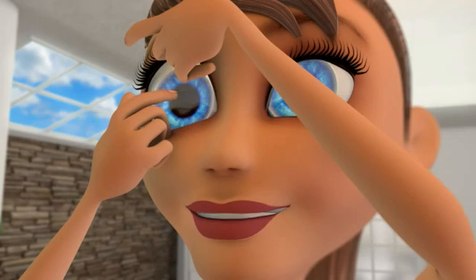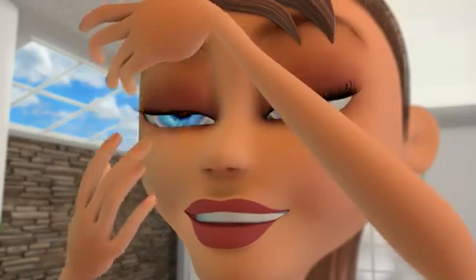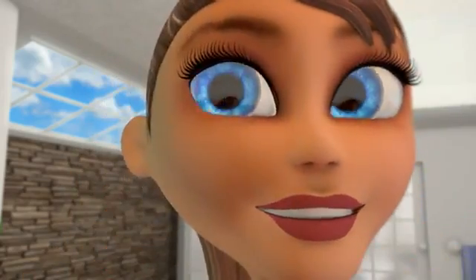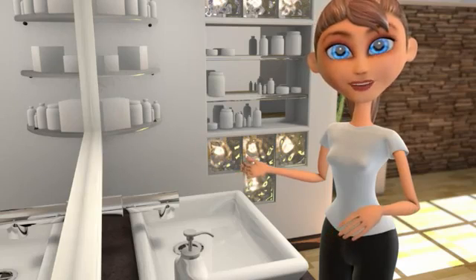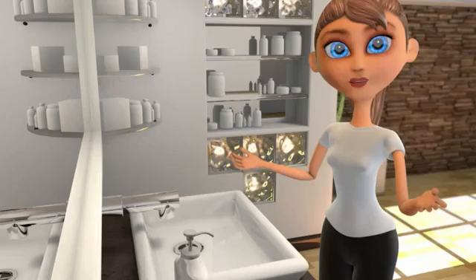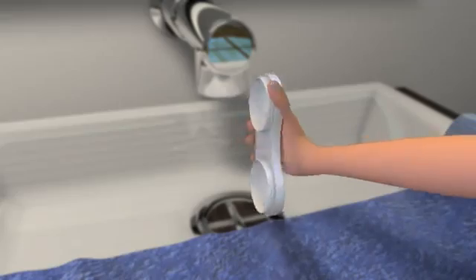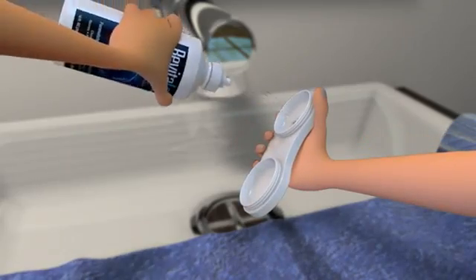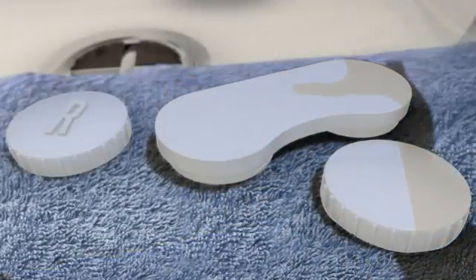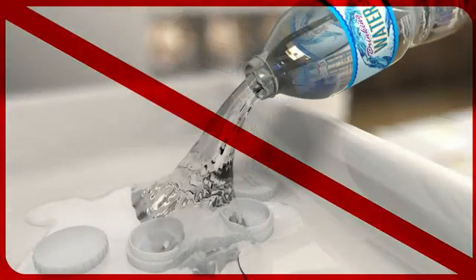Once the lens is in, look down to center the lens and slowly release your eyelids. Blink slowly and then repeat the same steps for the other eye. If at first you're having trouble putting in your contacts, don't worry — you will get it eventually. Just wet the contact lens with contact lens solution and try again. Afterwards, all that's left to do is discard the used solution, rinse the lens case with your contact lens solution, flip over the case and allow the caps and case to dry separately. Never rinse the case with tap or bottled water as they are not a substitute for contact lens disinfecting solution.